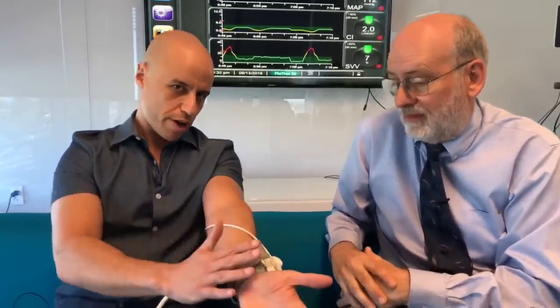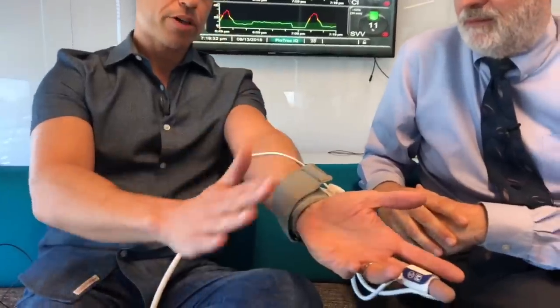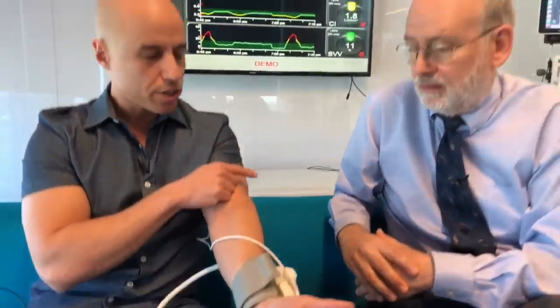So what we have here then is a non-invasive way to measure blood pressure in real time that gives our anesthesiologist and our OR team a real-time wave of what's going on with blood pressure. If blood pressure is important, which we're positing, the data is suggesting that it is. Blood pressure is important. Right. It also gives you a whole bunch of other information that we didn't used to have. Like what? Which is amazing.